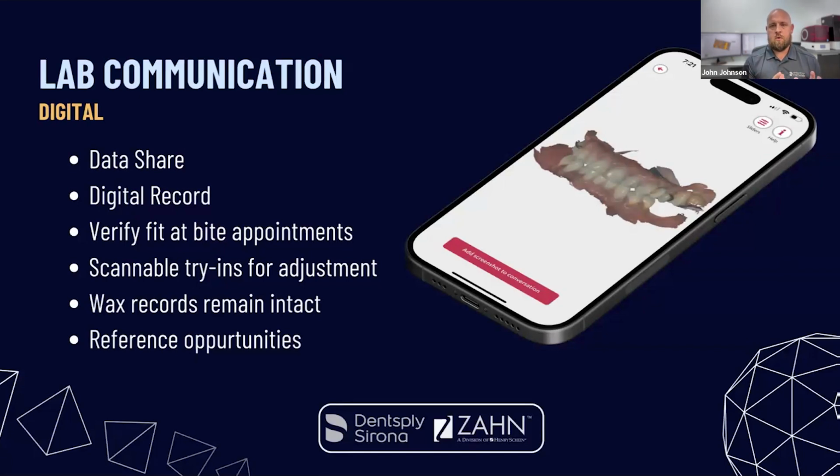Now, I talked about the digital record before. Digital records are really great if you wanted to reproduce a denture. They're great if you need a weirdo opposing model that you currently have. Like a clinician calls you up and says, hey, do you happen to have any models for so-and-so? Yeah, let me see what I've got. The mouth's an ever-changing place, but depending on the situation, you might be able to utilize some of those items. I talked about verifying the fit at those bite appointments, and that's a great thing. The scannable try-ins are great for the adjustments. It's a great communication tool. Like I said, we'll go more in depth on that. Those wax records remain intact.